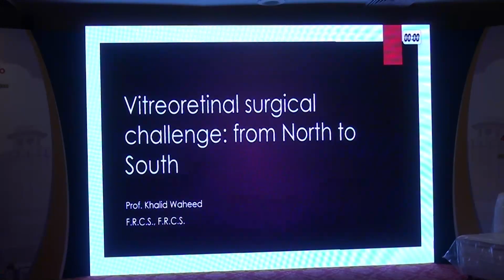The idea of showing the video is that first of all, as we are surgeons, we think, how are we going to fix this retina? Which viewing system is going to help us look through the keratoprosthesis, because the Boston keratoprosthesis is slightly different from the temporary keratoprosthesis that we use otherwise in patients with scarred cornea. Can you go to the video, please?